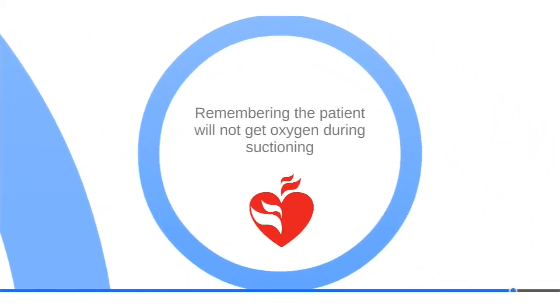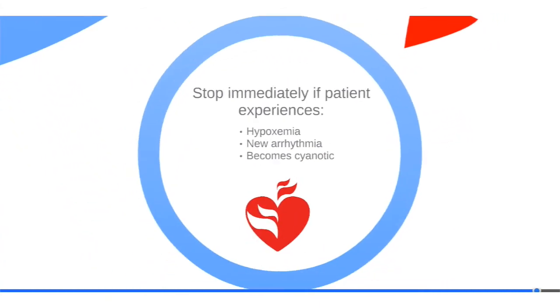Keep in mind that the patient will not get oxygen during suctioning. Monitor vital signs and stop if the patient experiences hypoxemia, new arrhythmia, or becomes cyanotic.